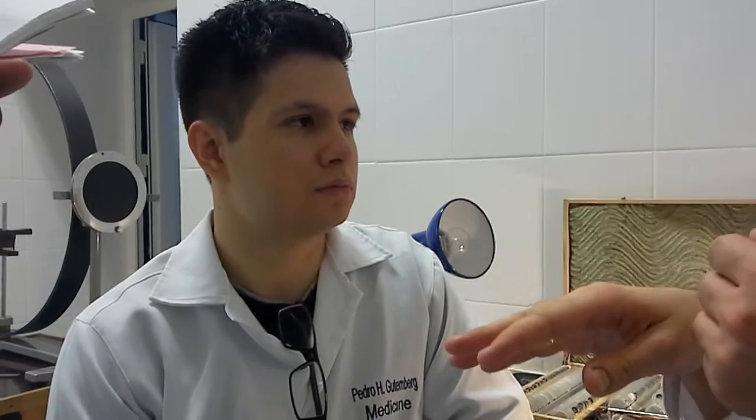Light from the flash comes through all the transparent mediums of the eye, through the pupil, through the crystalline lens, through the vitreous body which is behind the crystalline lens, and reaches the retina. It then returns to the photo film in the form of a reflex. The reflex changes color because the reflection comes from the pigment epithelium of the retina and the surrounding choroid, which consists of a great deal of blood vessels — and so this reflex is red.